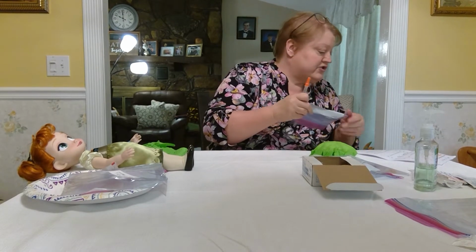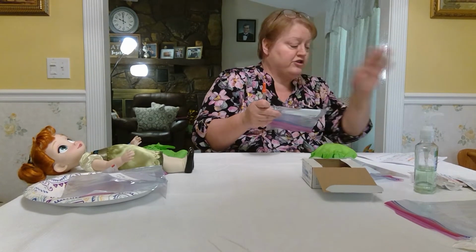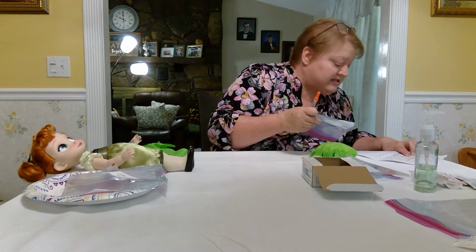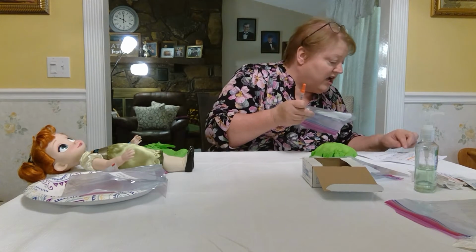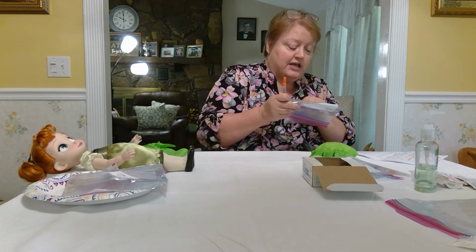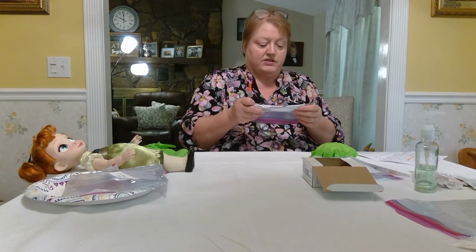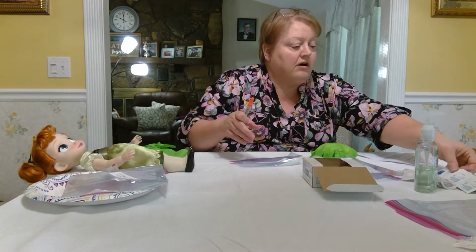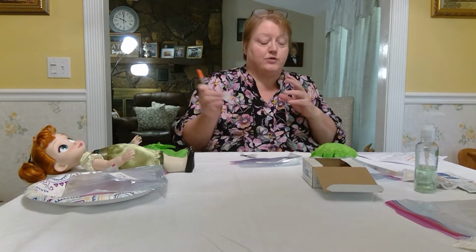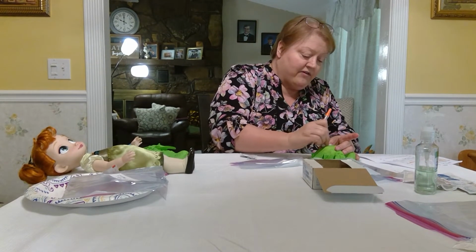Check your insulin again against your MAR for the final time. Miss Frozen, she's already said she has no allergies, and the MAR says she has no allergies. It is NPH 32 units, regular insulin 16 units, sub-Q together at this time on Miss Frozen. I'm going to take my alcohol. I'm going to do my correct location sites, which you will show us later. I'm going to clean the area.